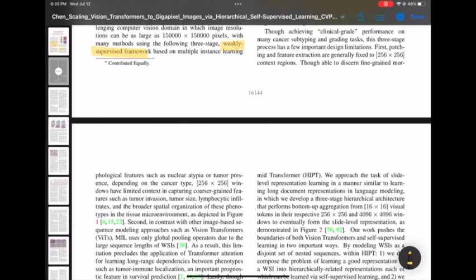There are limitations to this multiple instance learning approach that are addressed by a hierarchical architecture in this paper. The patch size is usually fixed, which means the models cannot capture features at different scales. Usually, the patches are 256 by 256 pixels, so they can distinguish changes in nuclei shapes that are typical in tumors, and they can identify if a tumor is present.